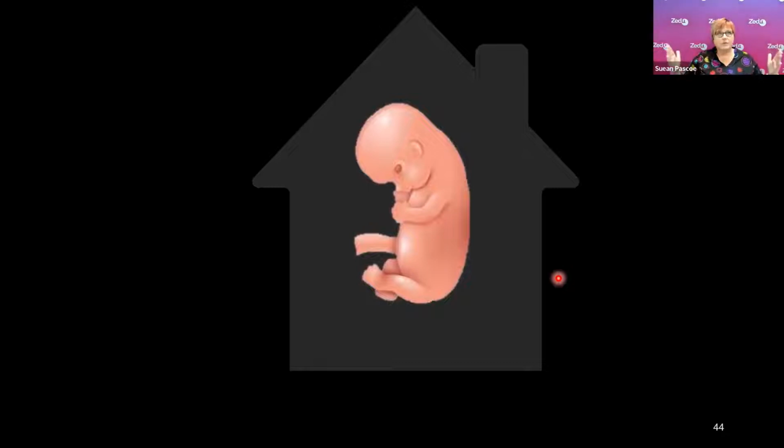And I first want to start with my lens and my options wide, and I'm looking for life and death things first. So I'm looking for signs of ectopic pregnancy first, and then I increasingly bring my lens or my focus of attention further towards baby. And that's because as much as mum wants to know, is this a viable pregnancy or not, because it's obviously very important to them, if we find a fetal demise, it's not a surgical emergency. It's not a life-threatening situation. It's very sad, but it's not life-threatening. Whereas an ectopic, we need to get onto that really quickly.